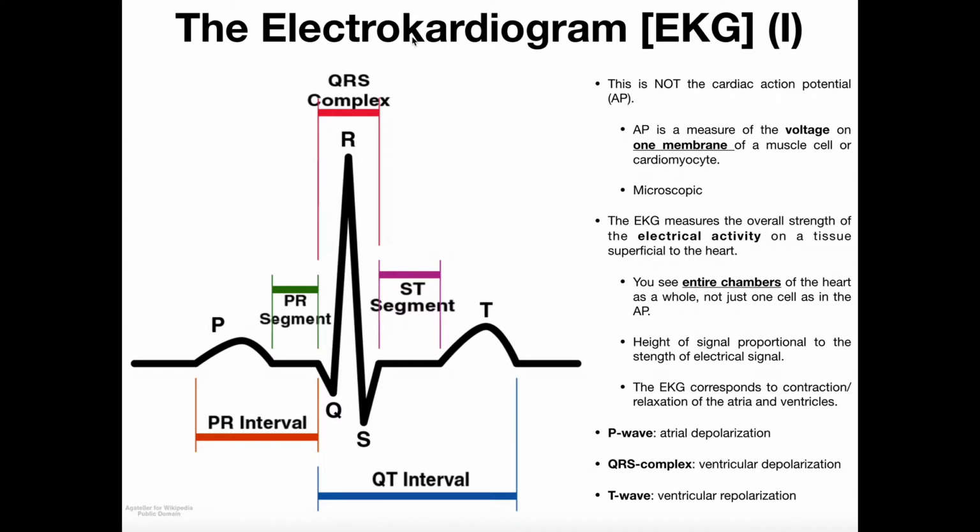In the United States, we like to be unique, I guess, and we use ECG. It's electrocardiogram, but the K instead is a C, so it's ECG. Although normally when you're talking about this, from what I've heard, usually we like to use the abbreviation EKG because when you're saying ECG, E and C and G all kind of sound the same. So K, the sound of it kind of gives some contrast. EKG, it's a little bit better to say that. In any case, let's look at the segments here.